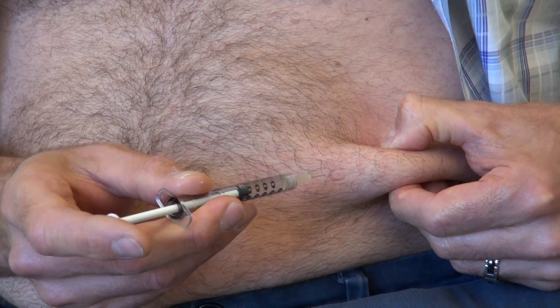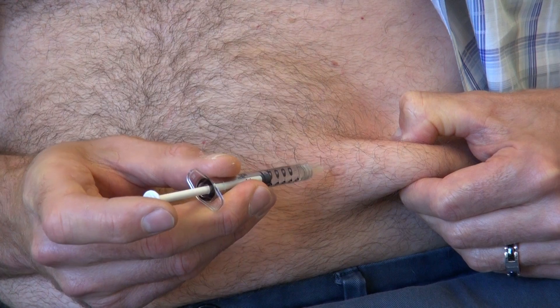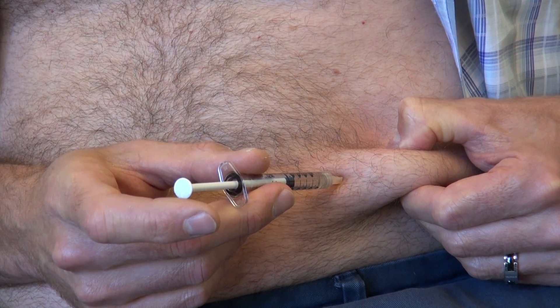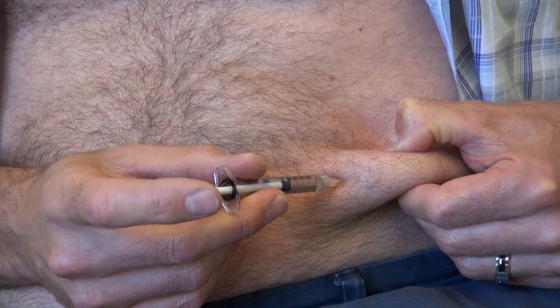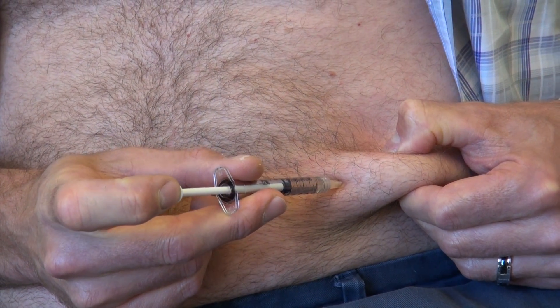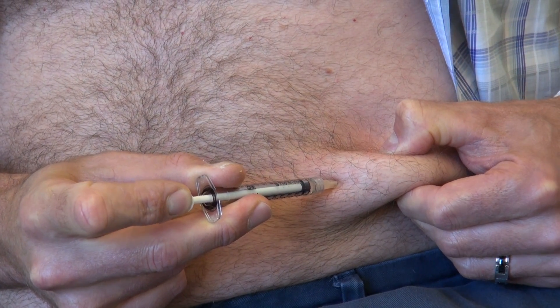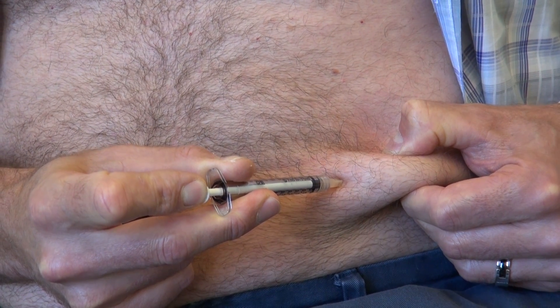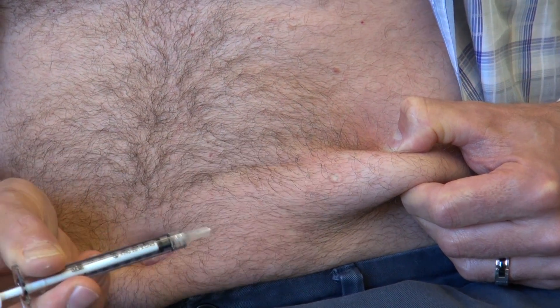With the circle visible, needle in position, give a good pinch and move the needle right through the skin. Rather than stopping at the surface, dimple in a little so the plastic hub is indenting the skin. At that point, start pushing the plunger to do the injection. Count to five before pulling out — four, three, two, one — then pull out and you're done.